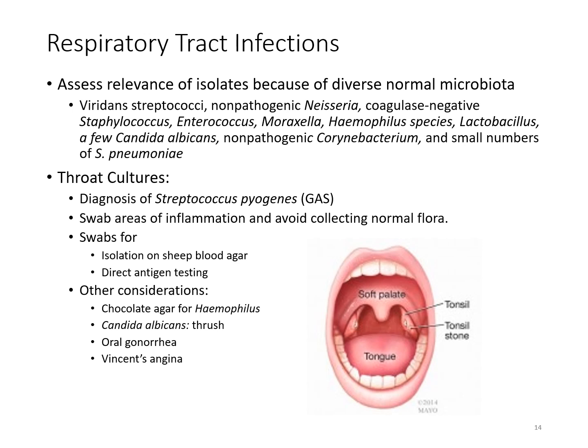Throat cultures, of course, typically we're looking for the organism that's going to cause strep, and you're going to swab the areas of inflammation to get that tonsil area, because you don't want to bring in any of the normal flora that resides within the mouth.